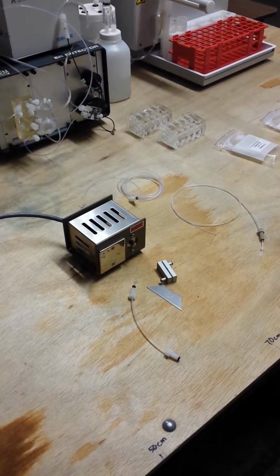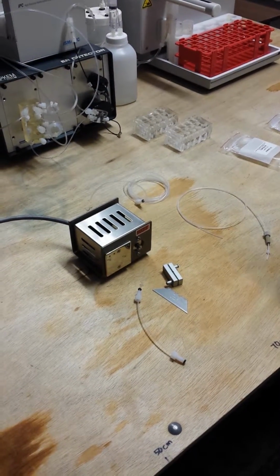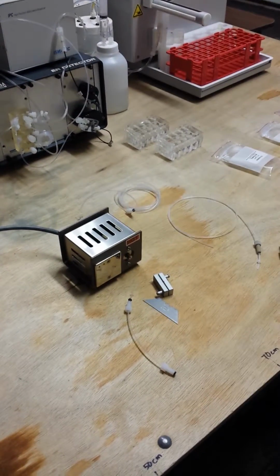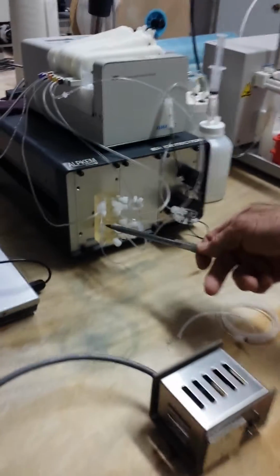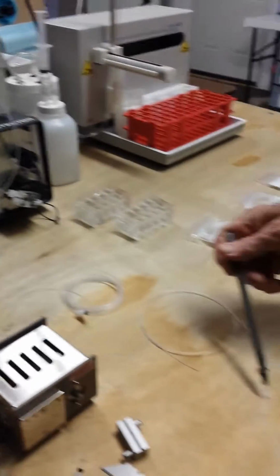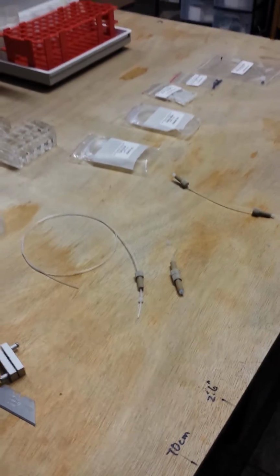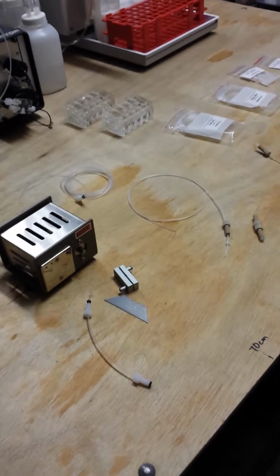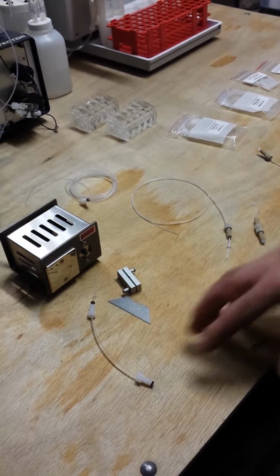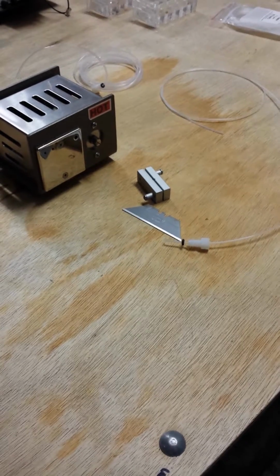One of the very important elements of an autoanalyzer or flow analyzer, whether it be FIA or SFA, are the connections. You'll see here on this cartridge that you have what we call flanged fittings, as opposed to a nut and ferrule. We often encounter systems with problems with reproducibility and peak shape and low-level sensitivity that are easily resolved by simply using a flanged fitting with Teflon consistently throughout the whole cartridge.